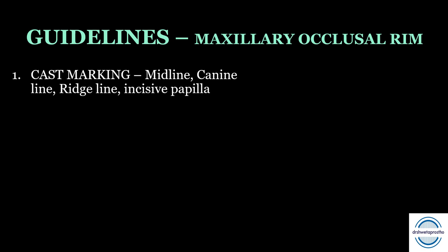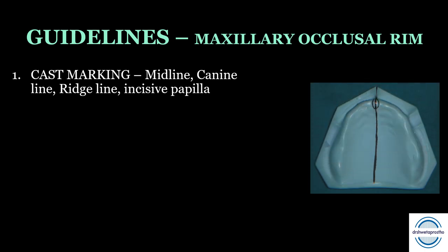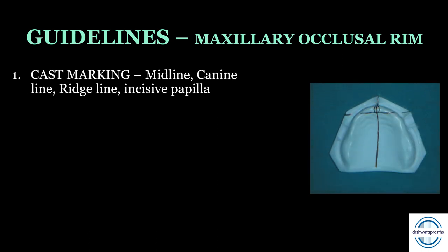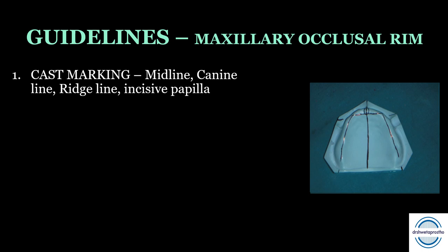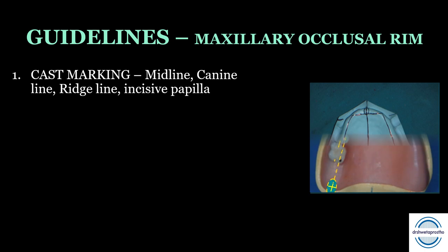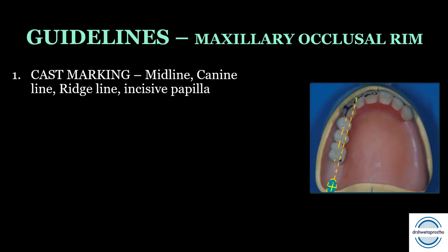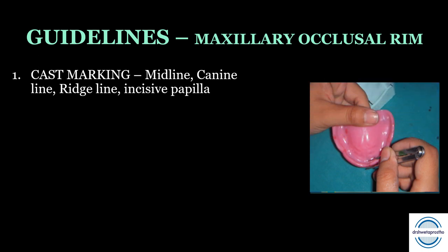Now let us discuss guidelines for fabricating the maxillary occlusal rims. First is cast marking: we need to draw reference lines to help fabricate the maxillary occlusal rim. These include the midline, which bisects the incisive papilla; the canine line, which passes posterior to the incisive papilla and marks the position of the canines; the ridge line, which bisects the major portion of the ridge; and the incisive papilla marking, as incisors are usually 7 to 8 millimeters anterior to it.